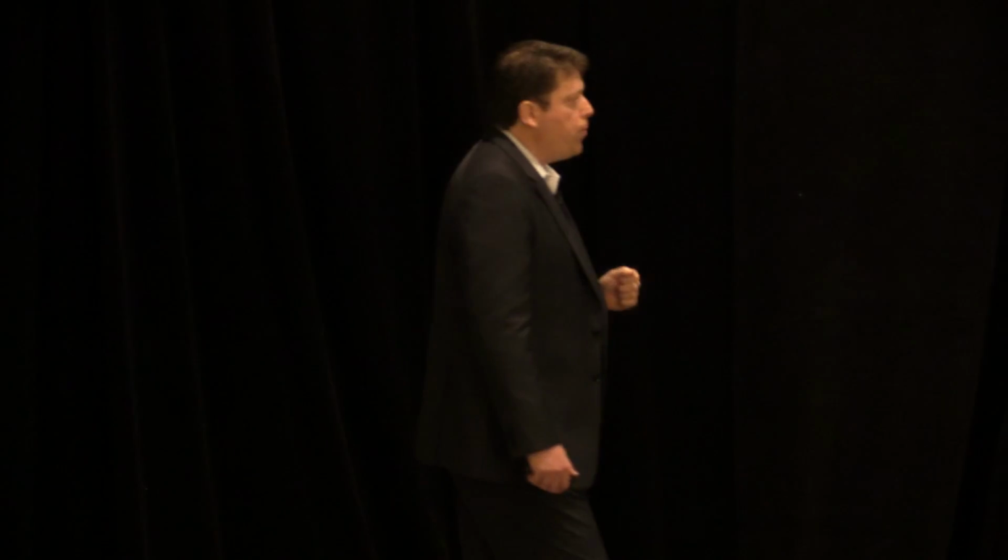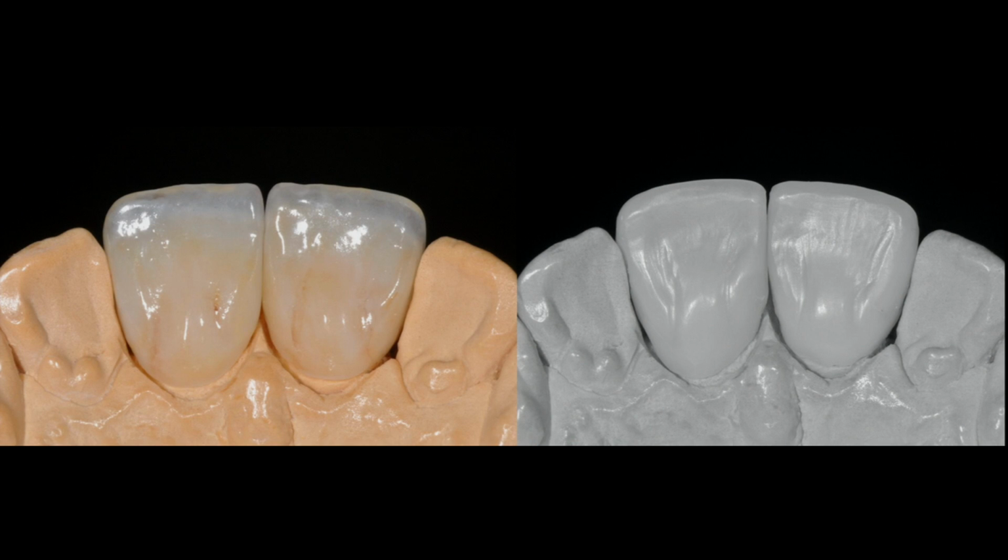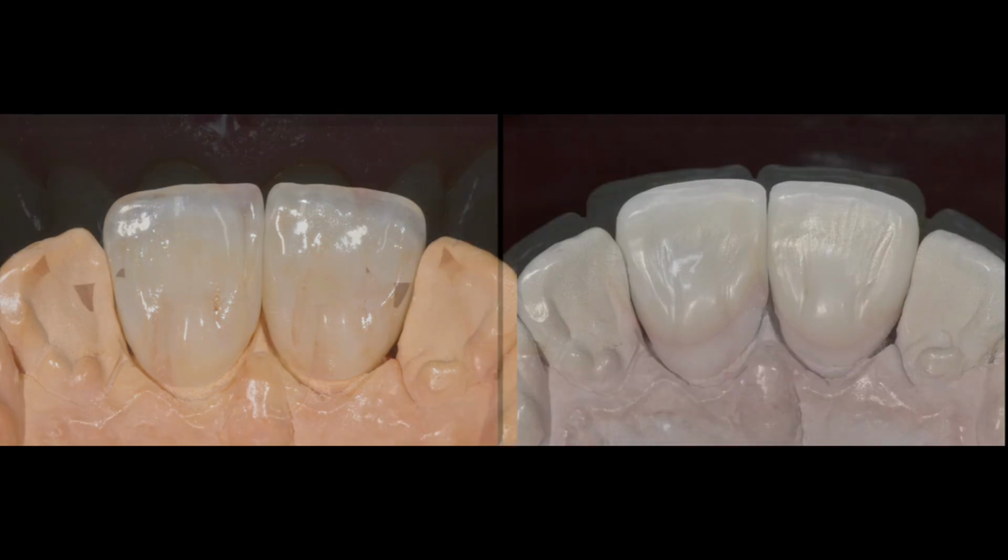On the palatal aspect, we're going to leave a full contour surface of monolithic, in this case, lithium disilicate, such as Emax, to allow for better durability in terms of function. And you can see that the palatal aspect of those definitive restorations on your left-hand side are very similar to the contours on the wax-up.